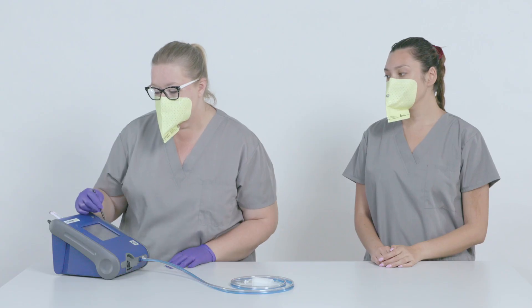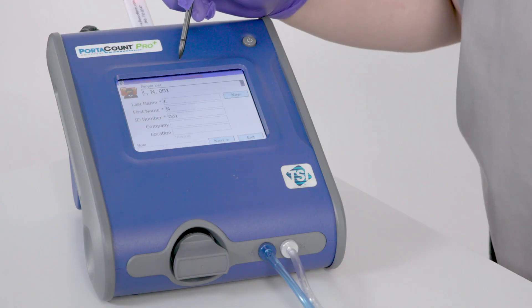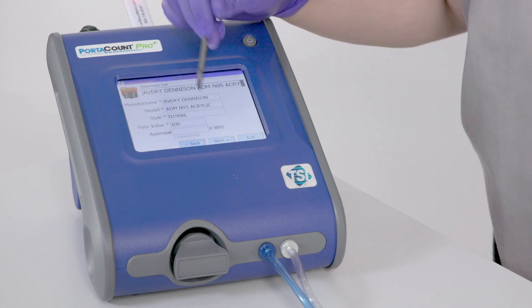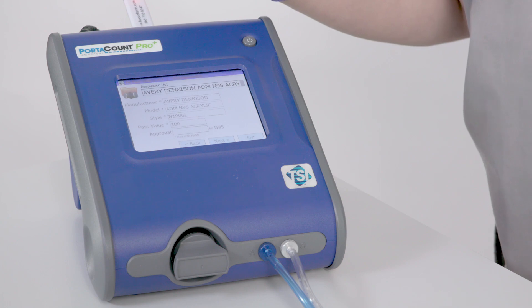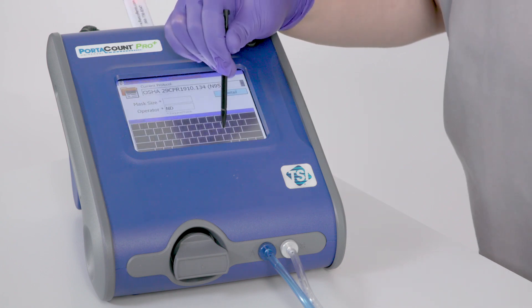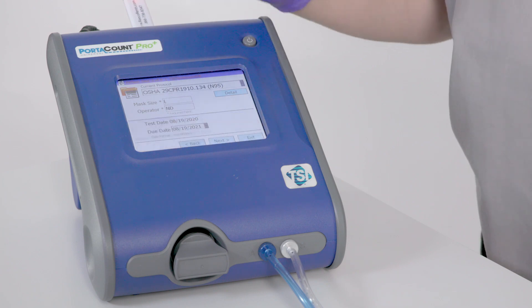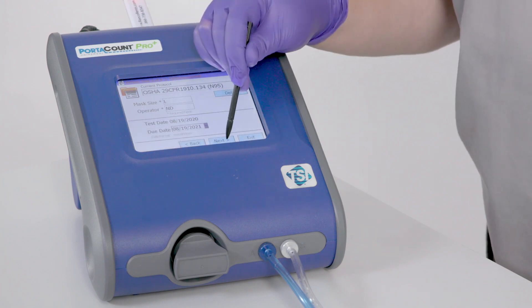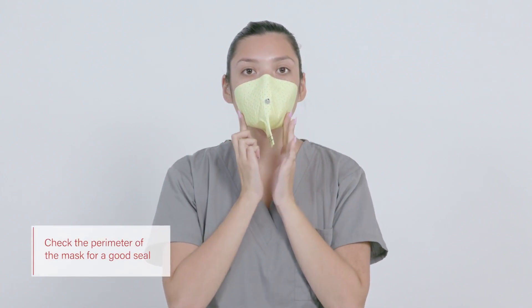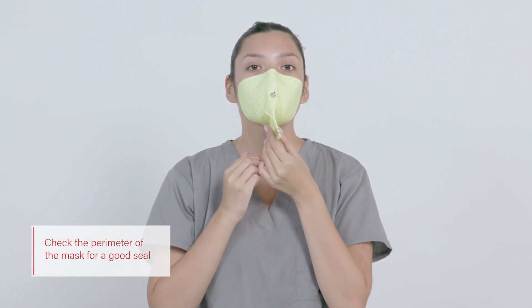Step five: test the mask. Enter the required information into the machine to begin the test, such as the subject ID, mask type, and mask size. Be sure to follow the manufacturer's instructions and facility protocols when conducting the test. Have the test subject complete an additional check around the perimeter of the mask to ensure a proper seal.